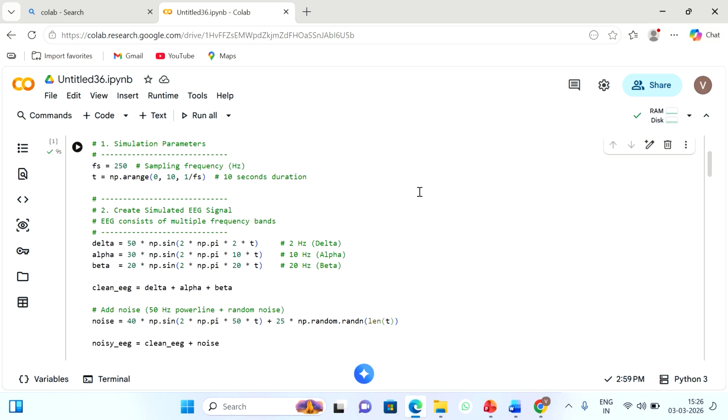And when we collect the EEG signal, it is not pure. In all biomedical signals, due to our body muscle movement and blood circulation, noise will be introduced, and due to the electrodes also, the power line interference we cannot avoid. Actually, high current will not occur, but due to the electrons and movement of the ions, a small amount of electrical signal will flow. So definitely the power line interference will occur.